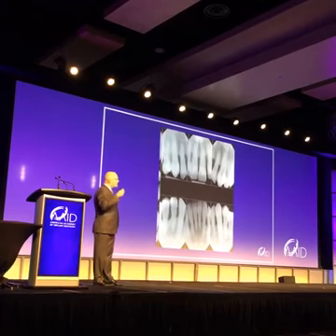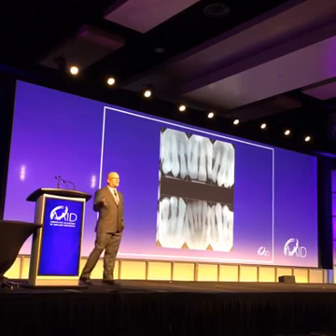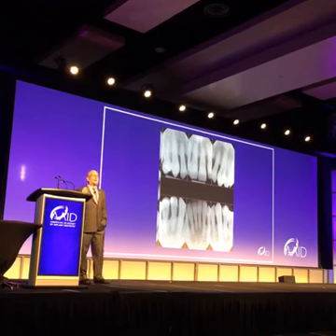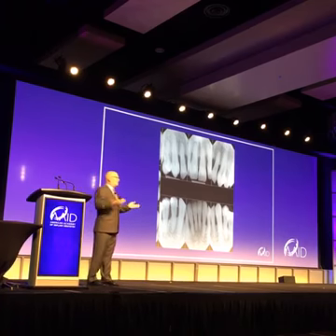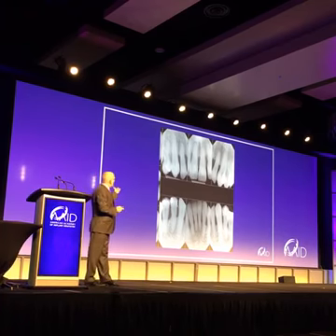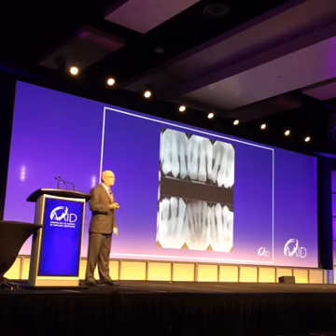So here he is, you can see how much bone loss he has, how much calculus there is. Doing scale and root plane, these pockets were 10, 11, 12 millimeter pockets. Scale and root plane is really not going to help that much. I wouldn't even call it duct tape. It'd be like doing nothing. And cutting is just going to leave him with a picket fence, which is unacceptable to me.